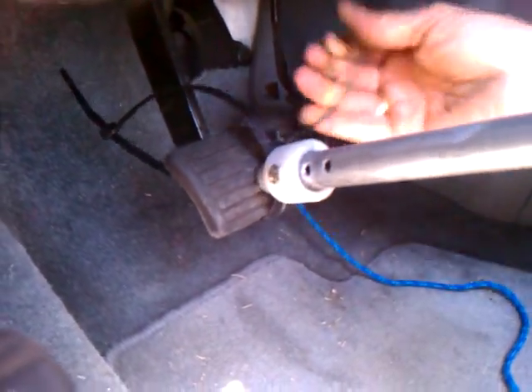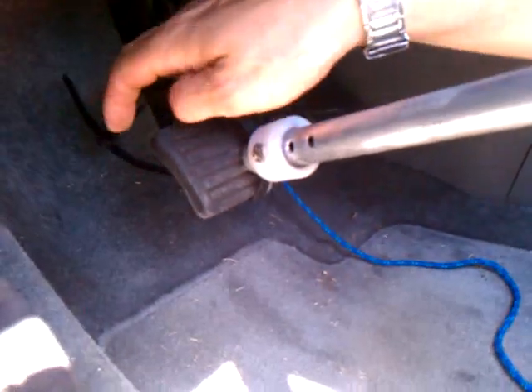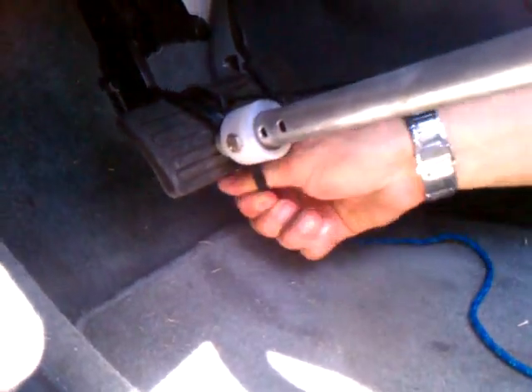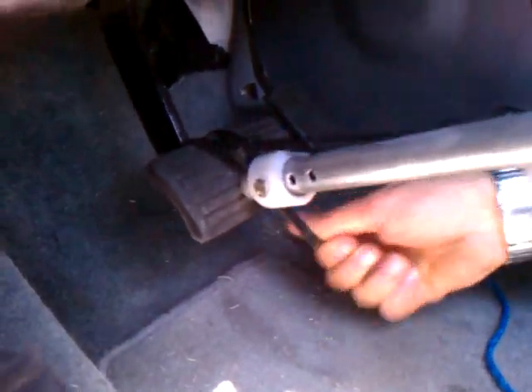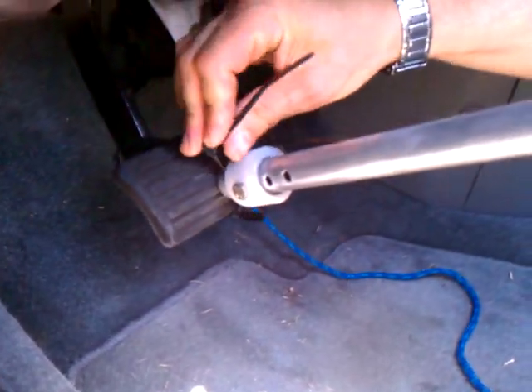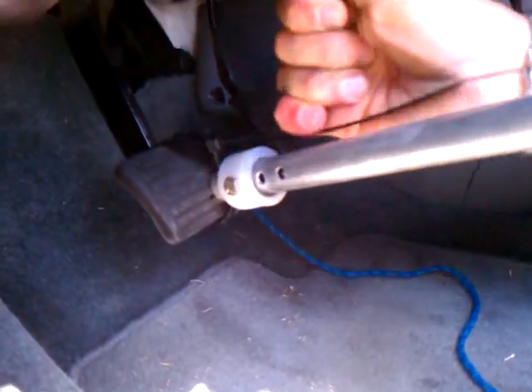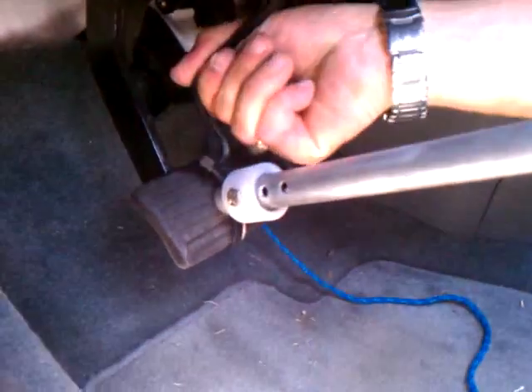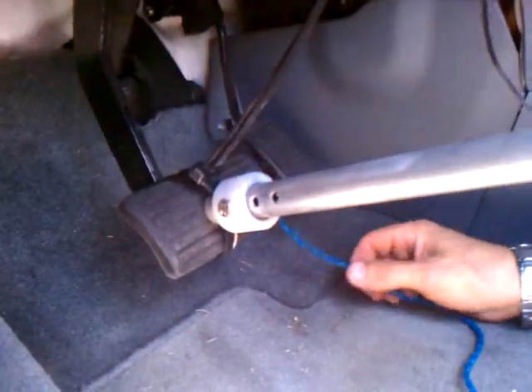Put those on either side of the brake — that's the important part. That's not going anywhere. Either side of the brake like that.